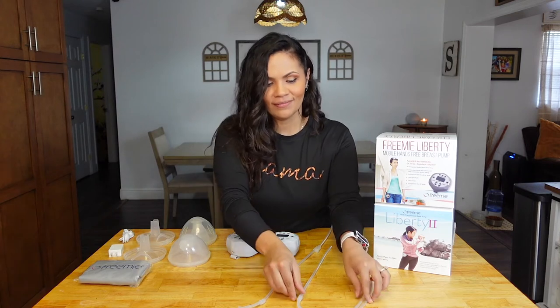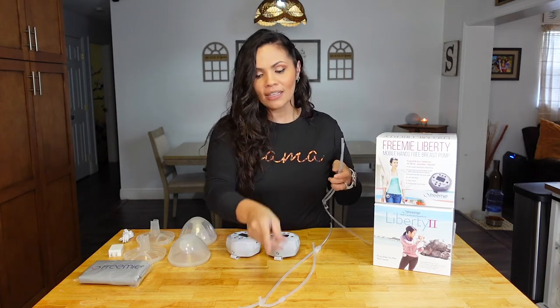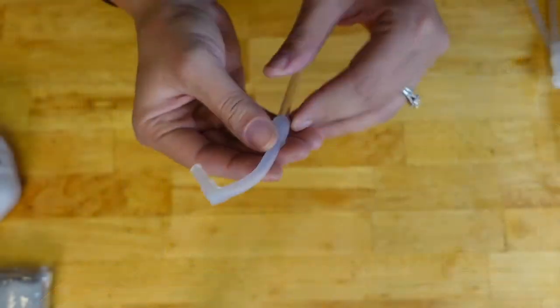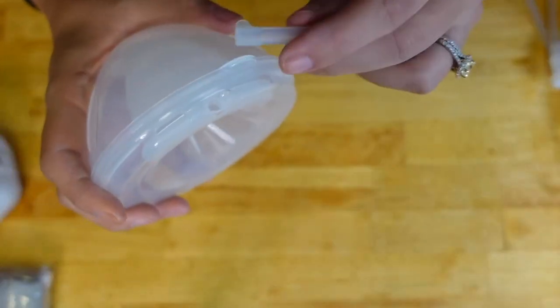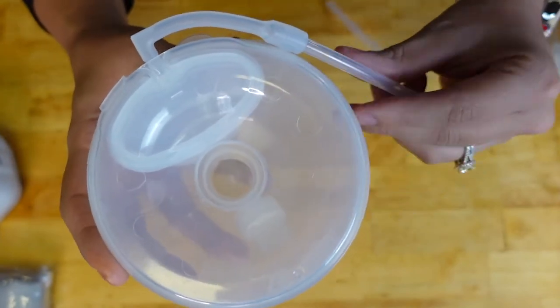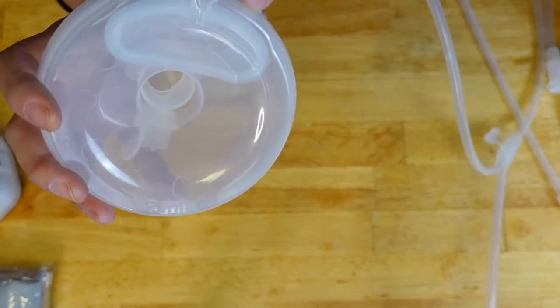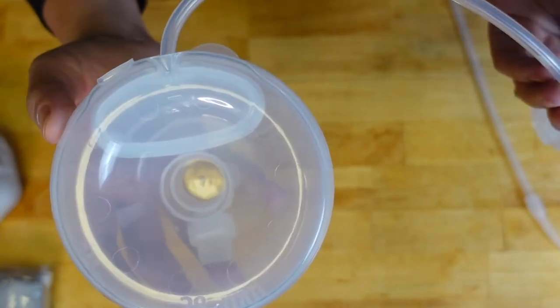Now, what has changed? The first thing I noticed right away that I absolutely loved is they included an L-shape adapter. In my first Liberty review, one of my defaults was that the top of the pump was visible — it wasn't as discreet as I'd like. FreeMie must have already thought of that because this came out about two weeks after my review. With the L-shape adapter attached to the cup, it hugs the shape of the cup, so even with a lower-cut shirt, the pump doesn't pop up and people cannot see it.